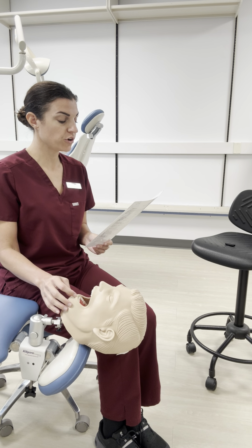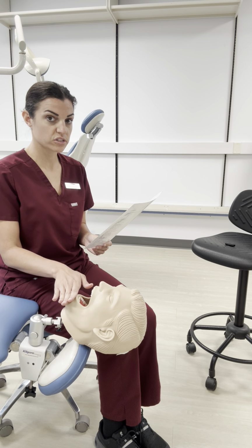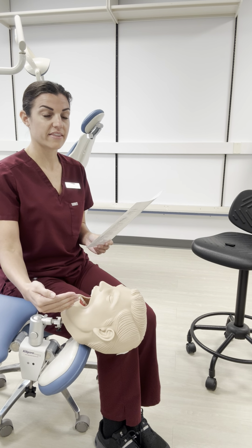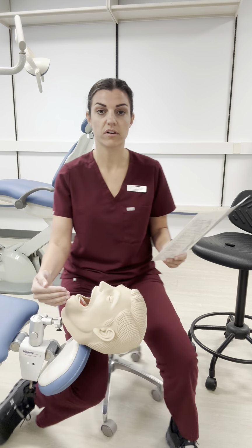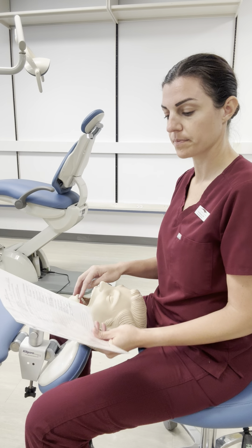Okay. Mandibular anterior labial surfaces away. Those facial surfaces on the side that is away from you, you're going to be at 12 o'clock. That way you can access those areas better.